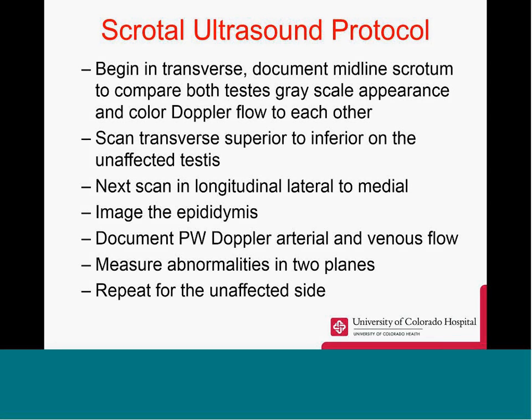We're going to begin in a transverse dimension, first documenting a midline scrotum. We do this to compare the testicles to each other. You're going to want to look at their grayscale appearance and Doppler flow.